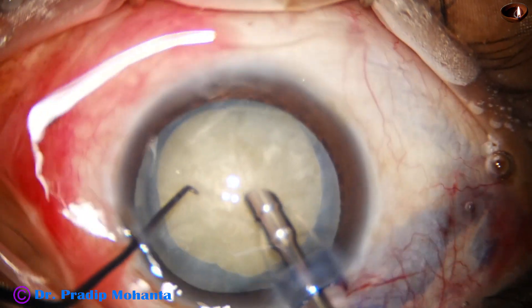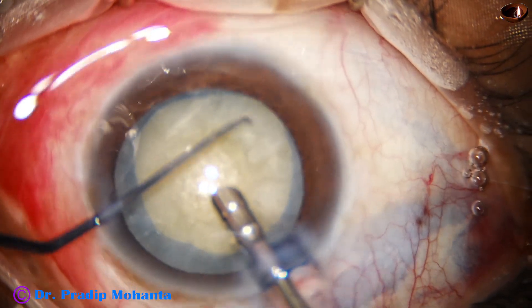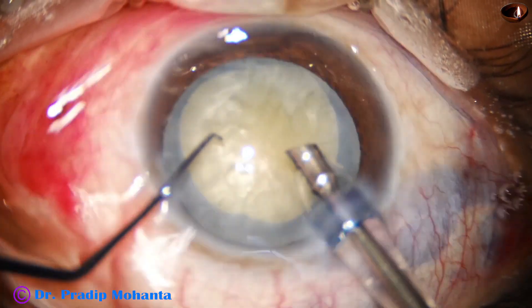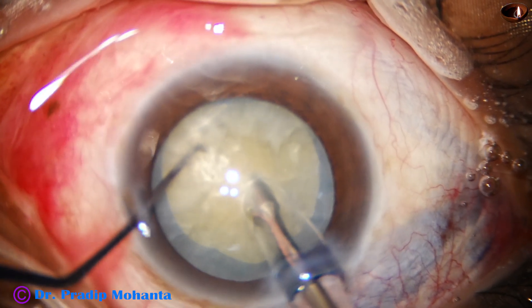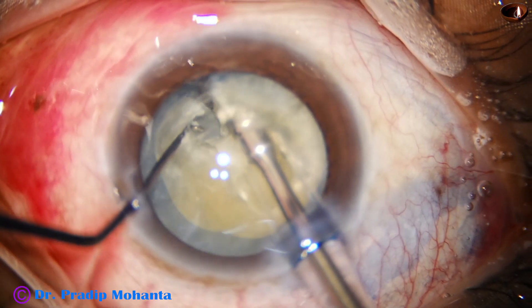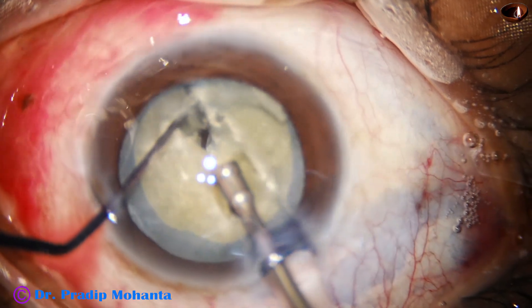There is some IFIS, so what I do is I lift the iris by the tip of the chopper. This is frequently happening — the reverse hydro effect. At the irrigation pressure, the iris is stuck to the surface of the lens and the surface of the anterior capsular rim, and the pupil dilates. And this is direct chop. I get a nice crack, and I make a second cut to go to a deeper level.